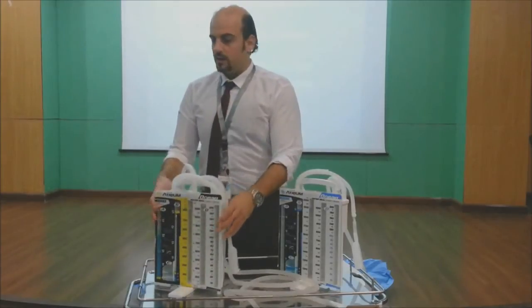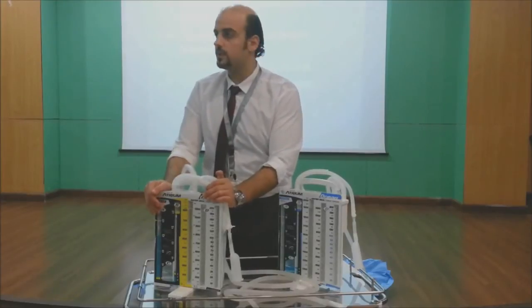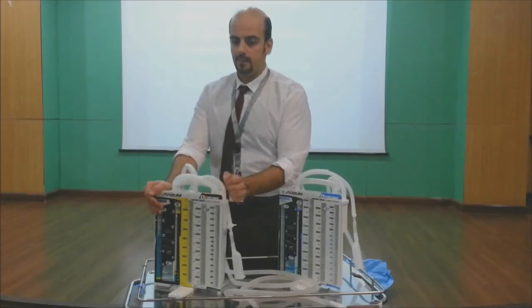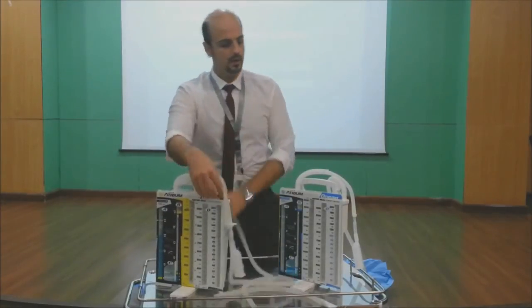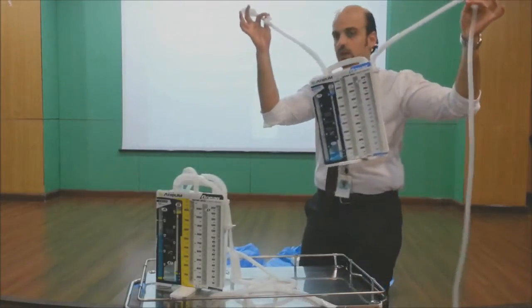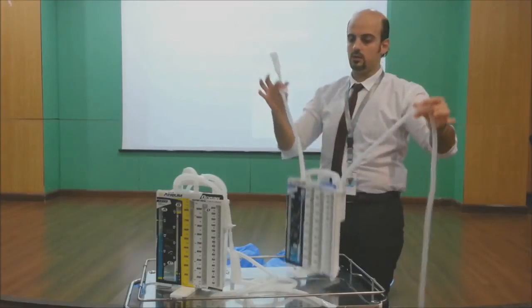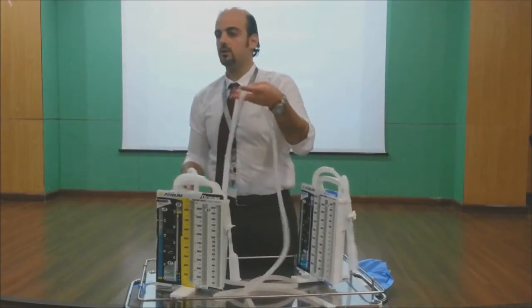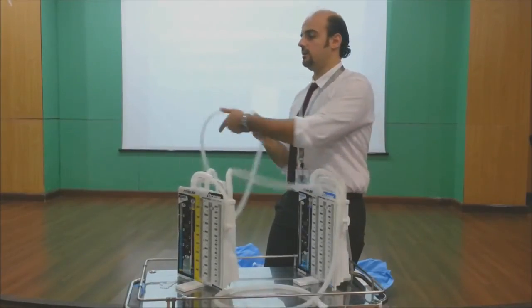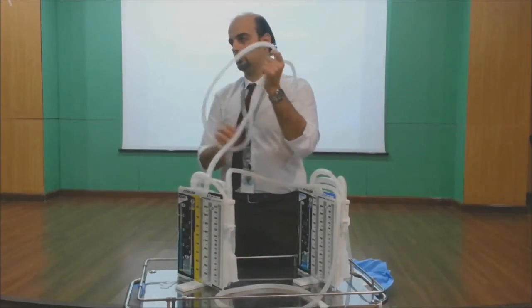There is a problem here. If we found this dual collection, what are we supposed to do? Close the other one, right? Why? Because this dual collection... see this single collection? It's sealed, closed. The air will come from here into the underwater seal and come out from the ventilators. You will not see it. But this one, if this is connected to the patient and this is to the air, what will happen? This is not secured, right? The air will come from here into the patient again. So the most important thing is to clamp this.